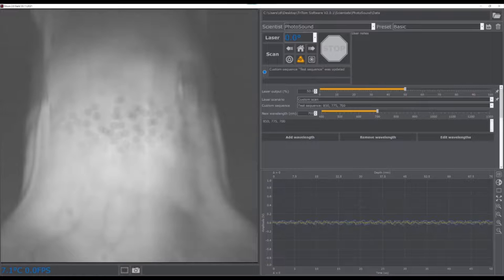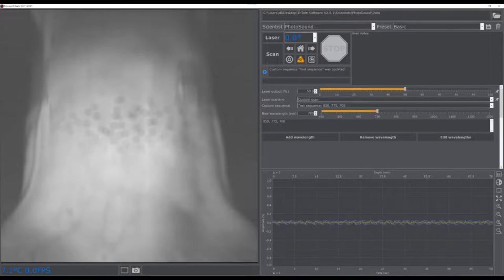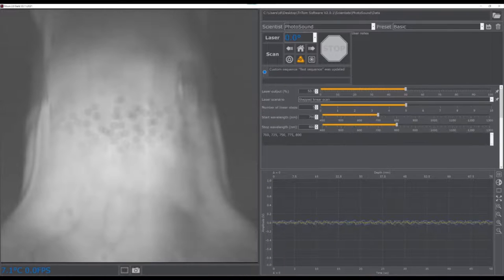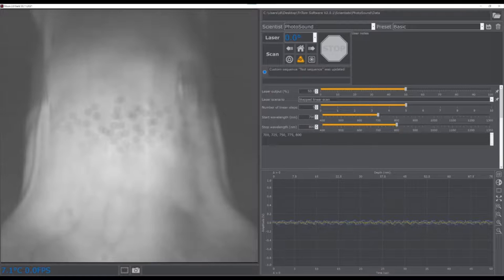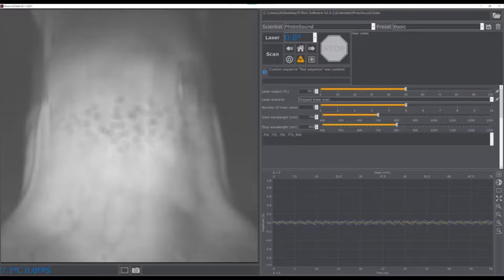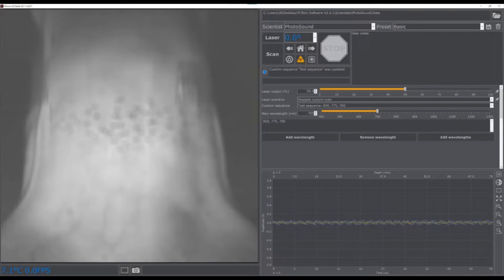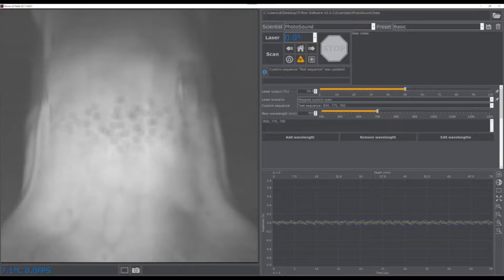A custom scan for imaging a set of user-defined wavelengths in a single scan, a stepped linear scan which acquires an individual scan for each wavelength in the defined linear series, and a stepped custom scan for acquiring separate scans for each of the user-defined wavelengths.